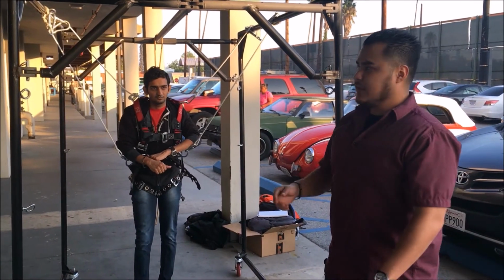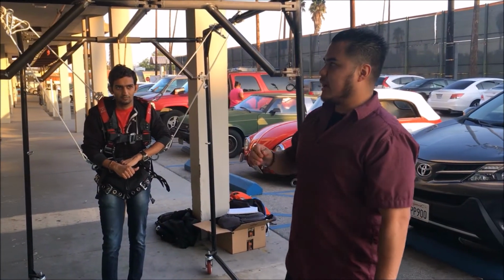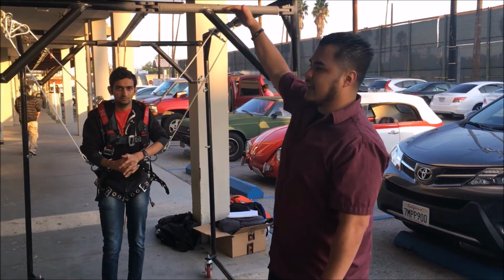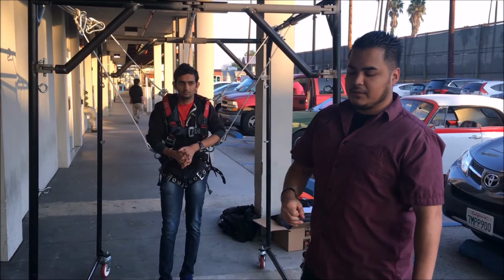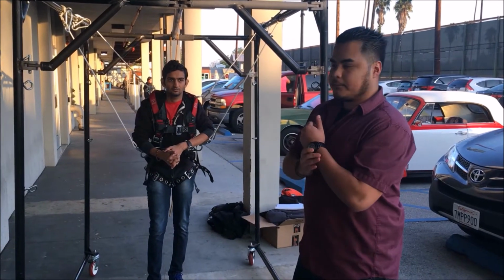Dan, it was a great help with welding it. It minimizes the deflection by having less of a moment. And basically this is acting like a cantilever. So when it's acting like a cantilever, it pretty much reduced the deflection by at least half with the addition of the gussets.